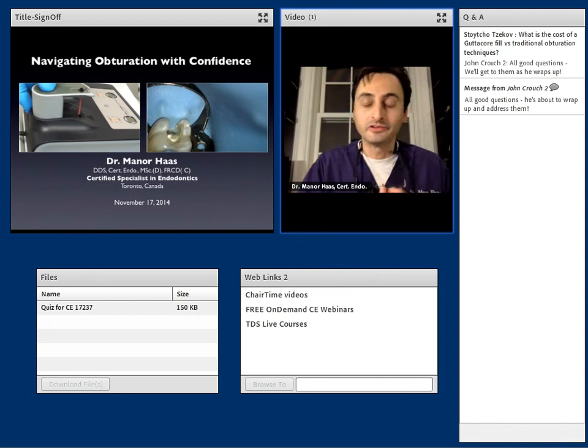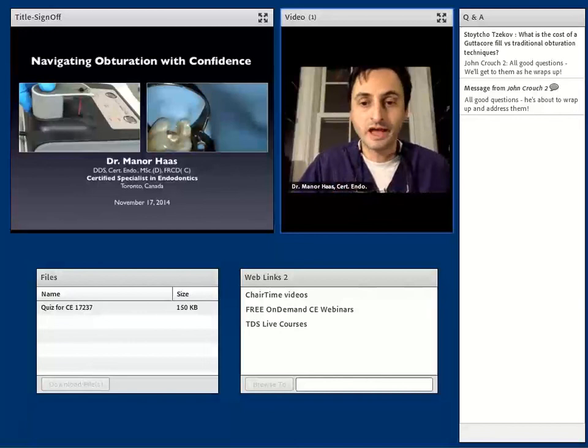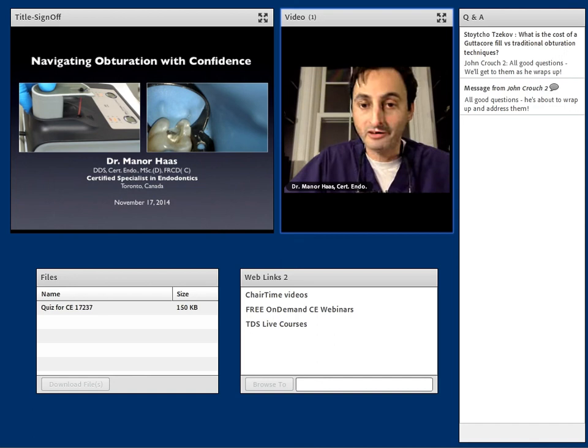So you want to seal the complete root canal system, not just the canal. You want to seal the canal system. And so aside from voids not looking good, and someone one day down the road saying, who the heck obturated this thing and having an issue with it, you want to have a complete fill of the canal system. So thank you for asking that question.